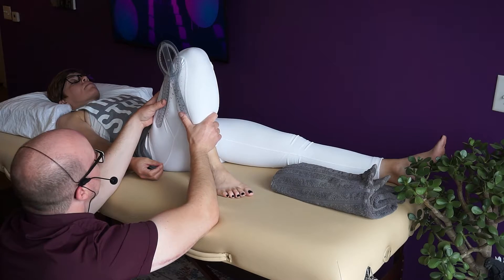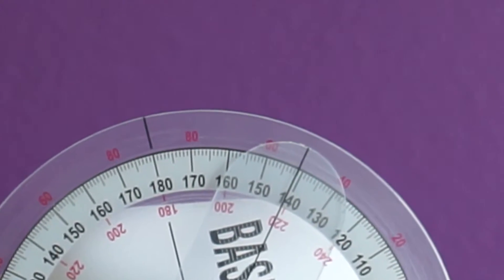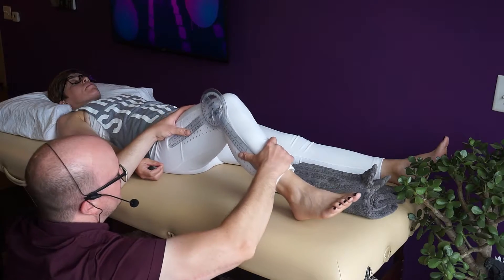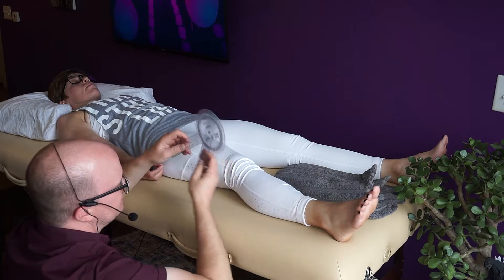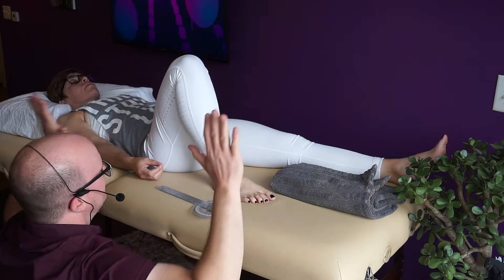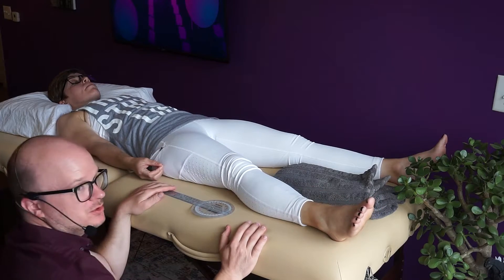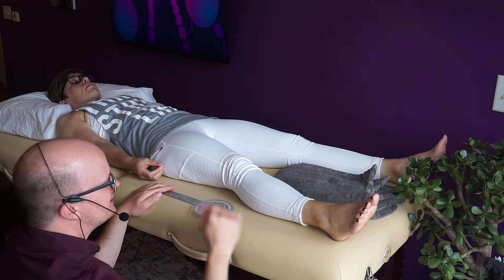With passive pressure, I was able to get her to 142 degrees of knee flexion. Pass or fail on your practicals — you have to bring that measurement back. If you take that measurement and let go and it just drops down, that's a fail and you have to redo the whole practical. So that's knee flexion: active, then passive motion.